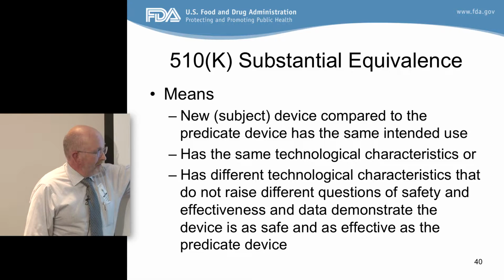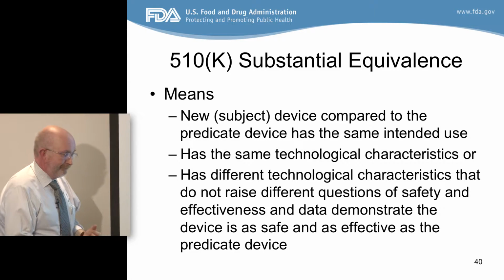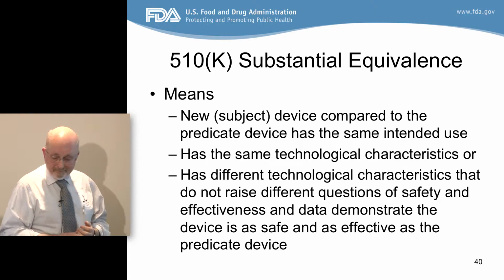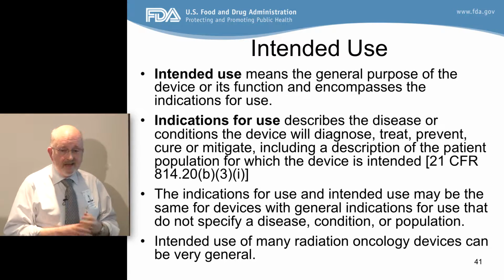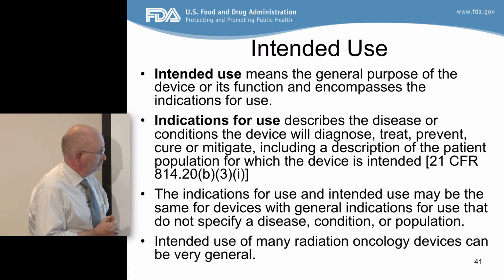The manufacturer compared their device to a predicate device. And in some cases, linear accelerators, they've been doing this for a long, long time. And now we get into that tool claim, where it gets our division in trouble.